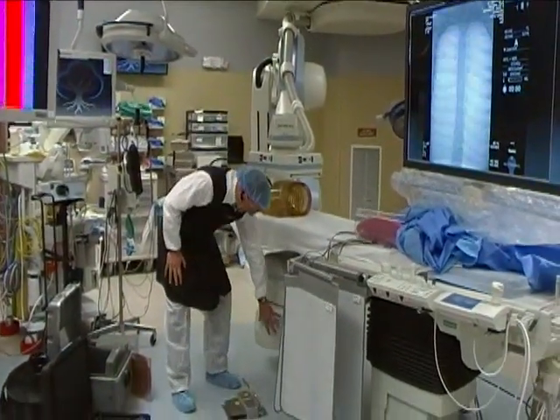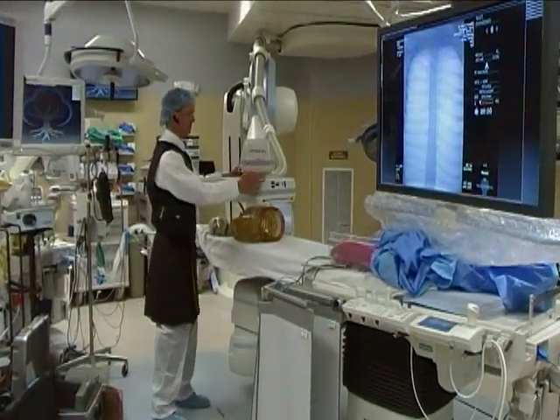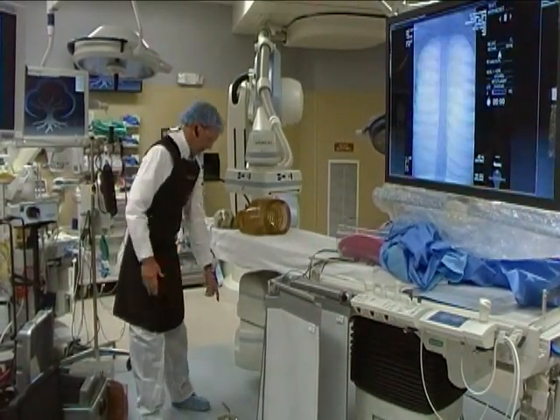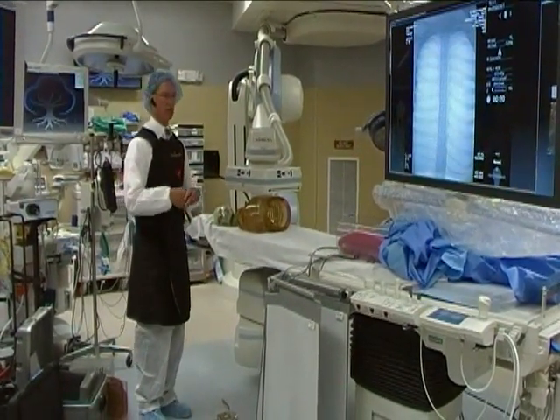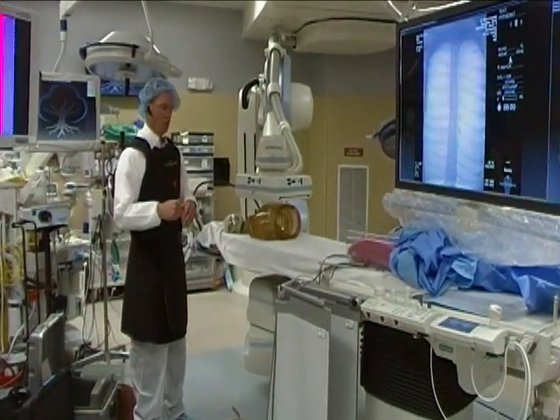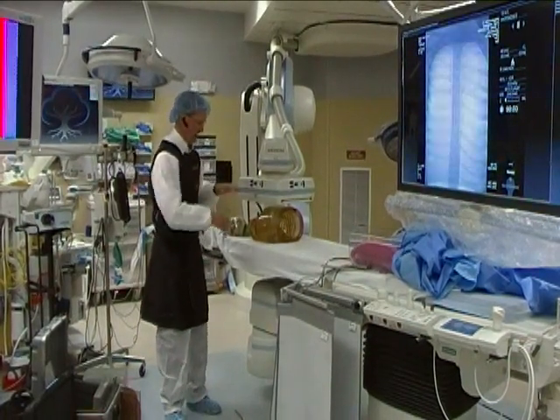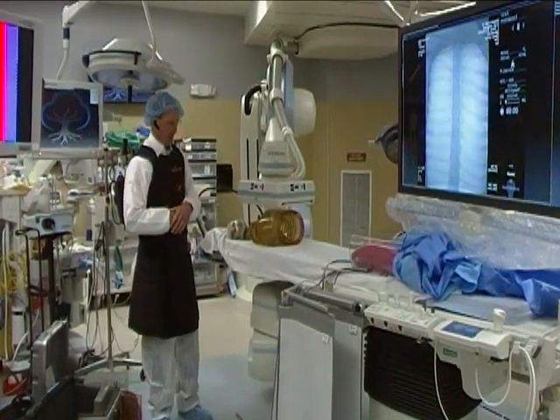Start with the very basics. The x-rays come from the x-ray tube, which is this device down here, go through the collimator, up through the patient, and are attenuated and collected by the image receptor, which is this device here. The source of scatter radiation for the staff is not the tube, it's the patient in between. So if you're concerned about where the radiation is coming from, it's coming from the patient. There is more scatter going back down beneath the table than there is coming up above the table in a position like this, where it's anterior or posterior anterior.